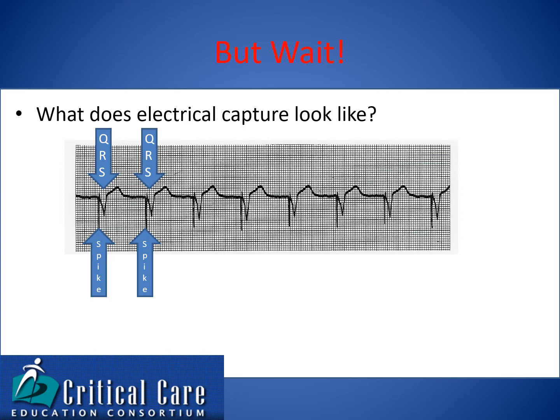When the ventricle is paced, the complex appears like one that originated from the ventricles, because you're only pacing the ventricles, and on one side of your ventricle, so it's going to be wide. It doesn't go down the bundles of His that would cause you to have a narrow QRS. You would see it almost looking like PVCs or idioventricular, but it's not premature, and it has a pacer spike right before. We're going to look at strips of paced rhythms later in this presentation.